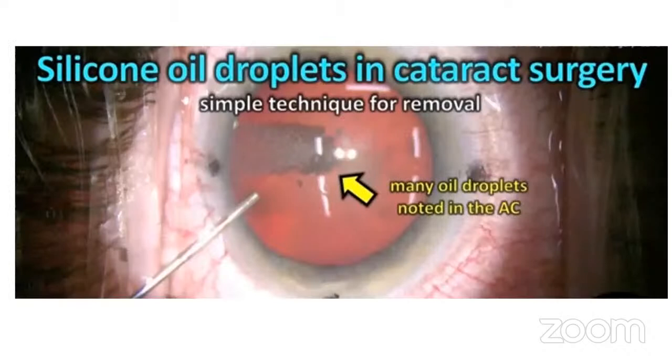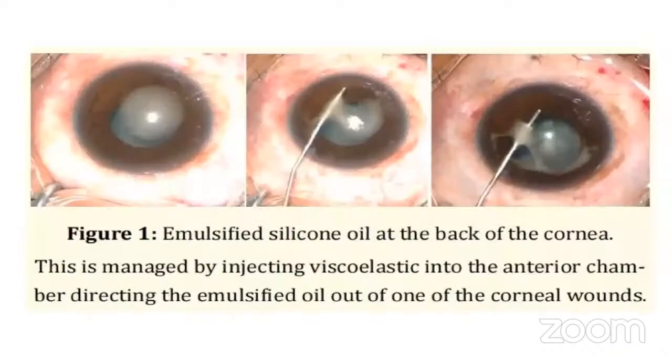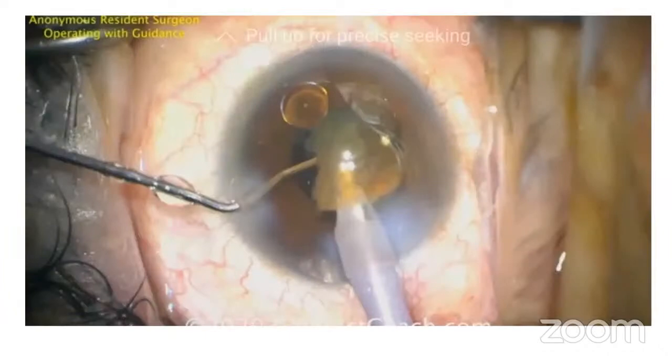Here you can see emulsified silicone oil droplets in the anterior chamber. By injecting visco in the anterior chamber, we have to direct the oil out. Again, here you can see emulsified silicone oil in the AC. Here, during the lens nucleus manipulation, you can see the silicone oil bubble which has entered the anterior chamber. It can be removed by suction, or you can again inject viscoelastic to remove the silicone oil.